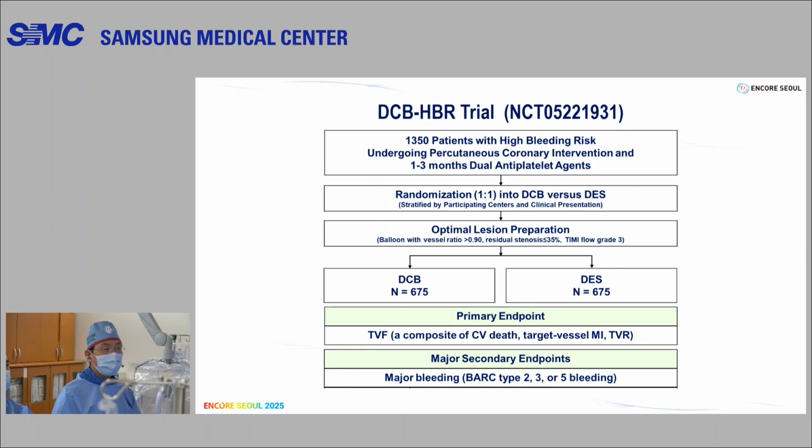So creatinine level is 2.0, 2.1, and eGFR 22. We are very careful not to overuse contrast dye. The angiography on the screen, please. Today's angiography, please. It's coming.